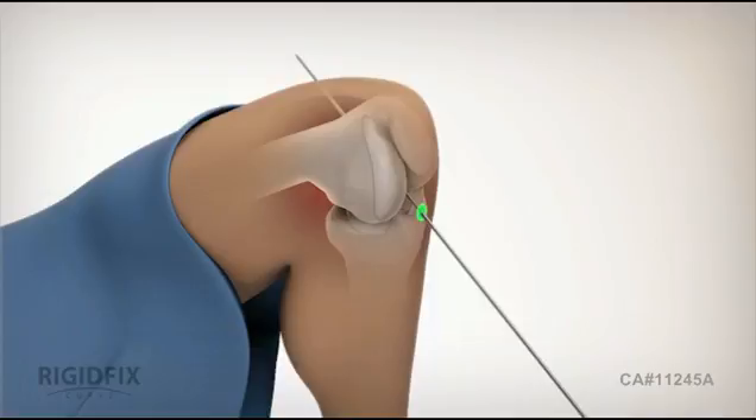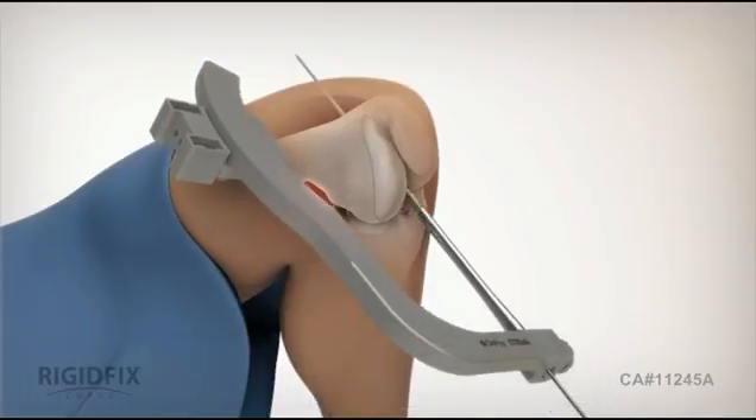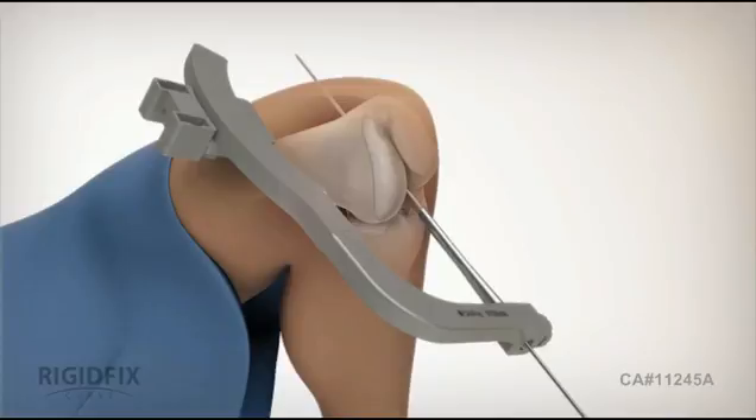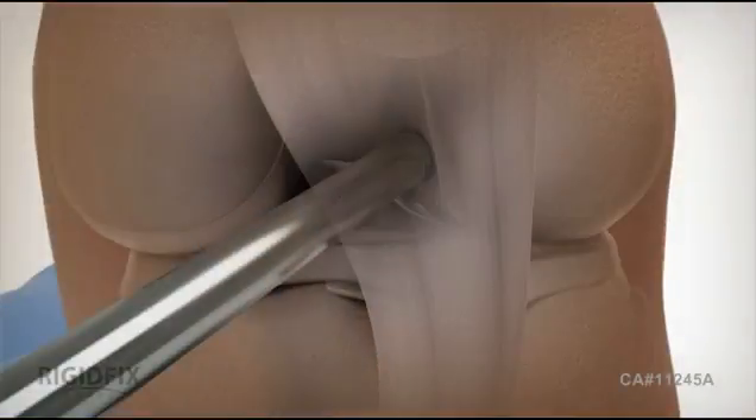Pass the femoral rod and curve assembly over the guide pin. Then insert the rod into the femoral tunnel, ensuring the frame is located on the medial side of the knee. The frame is marked left and right to correspond with the operative knee. Make sure the femoral rod is inserted to a depth of 30 millimeters. Then remove the guide pin.